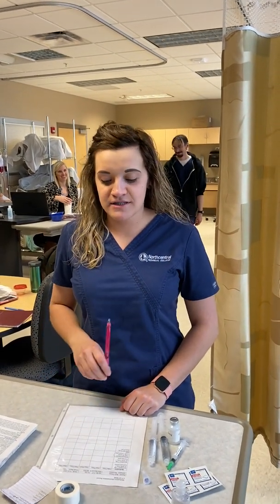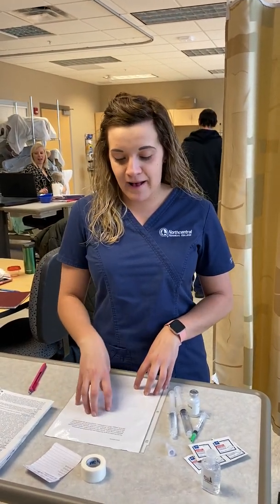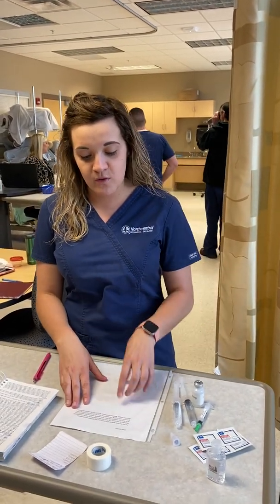Hi, I'm McKenna. I'm a student nurse and I'm going to be demonstrating how to give a medication via central line. So the first thing you're going to want to do is check your MAR and check your order. So I have Bob Owens here who is admitted with pneumonia.